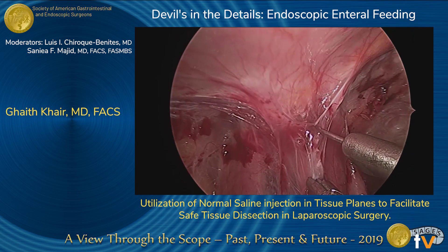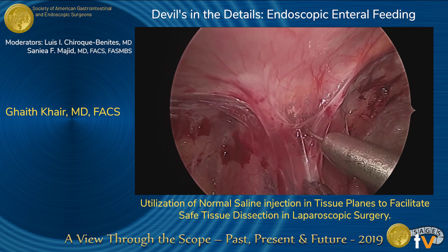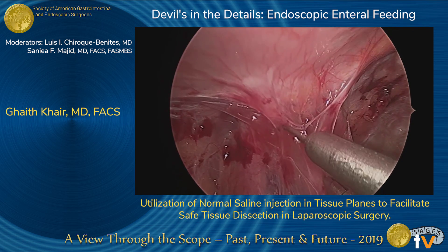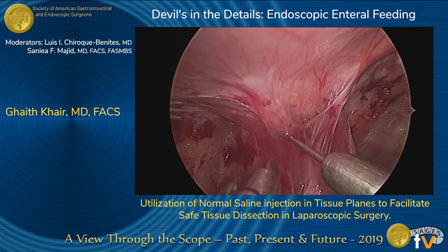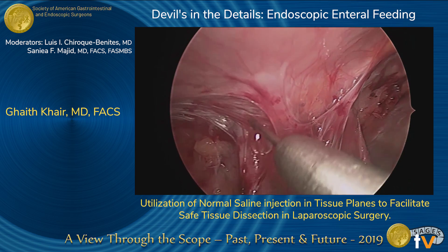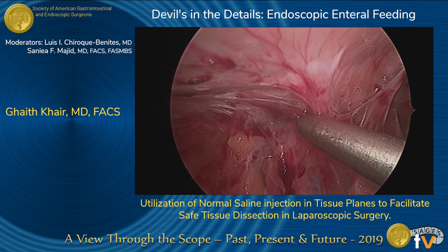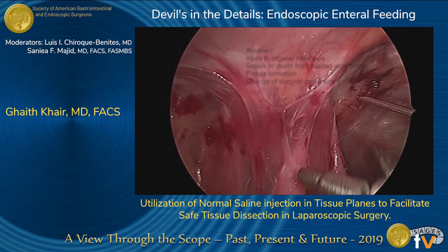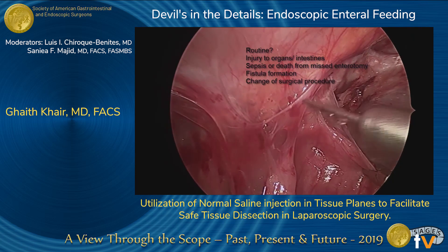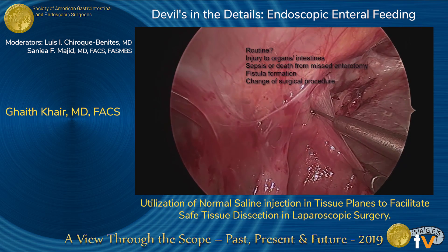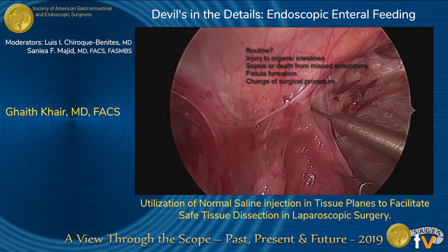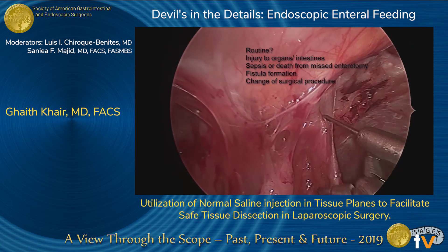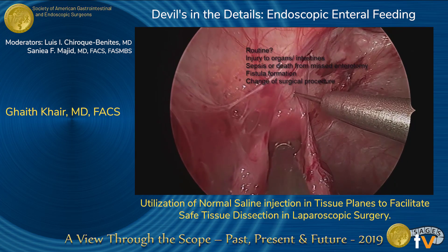In this clip, we will see the versatility of injecting the saline. This is a complex adhesion where the planes are not easily separated. We inject saline right next to the abdominal wall. If the lysis of adhesion is not carefully done, it can lead to injury to the intestine, adjacent organs, sepsis or death, or fistula formation.